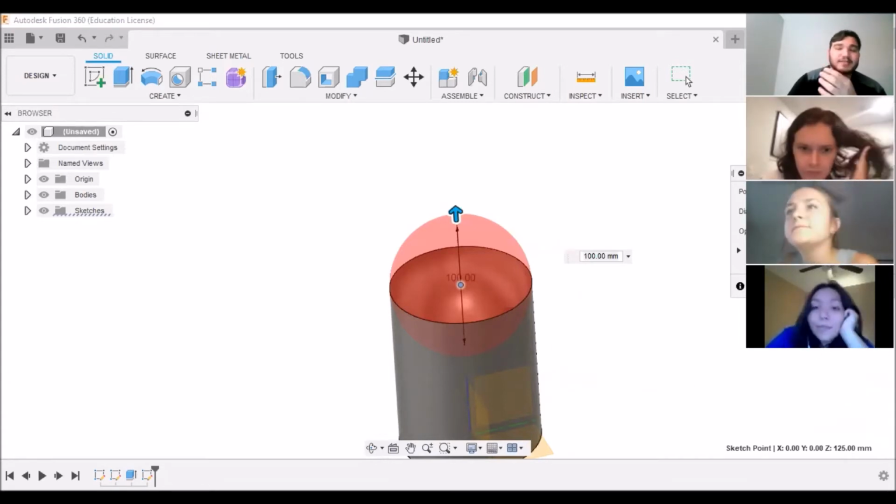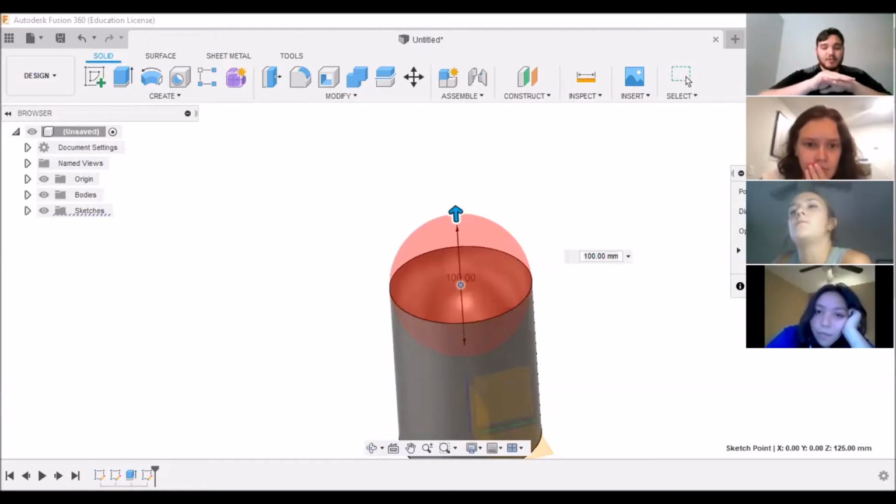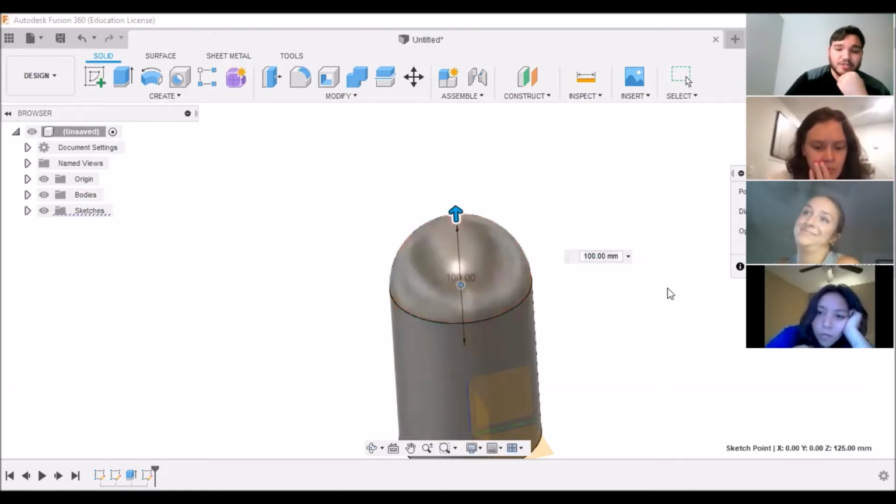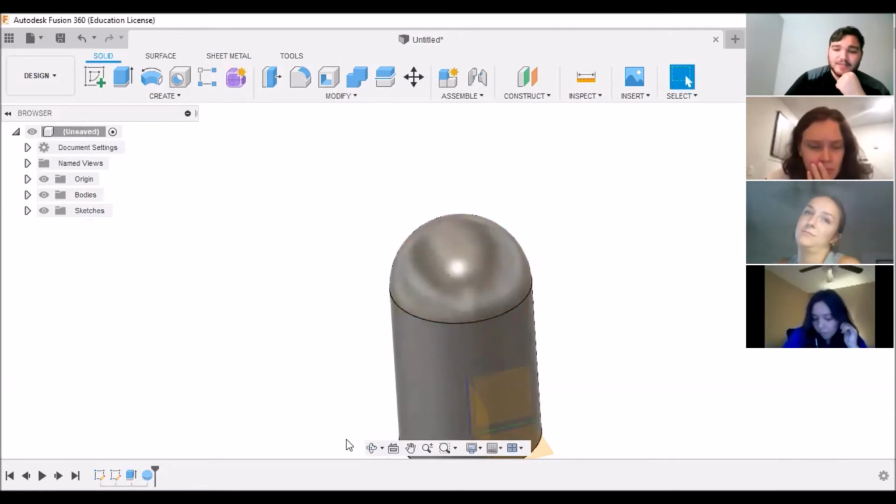Since it's automatically deemed a cut, since we're saying that, hey, it's on a specific geometry that we've already established, once we create a new geometry, we're assuming that that's cutting into the one that's already been made. So in this instance, we want to create a join operation. You click on the drop down, click join, it changes colors, and now you can press OK, and this has become one body.